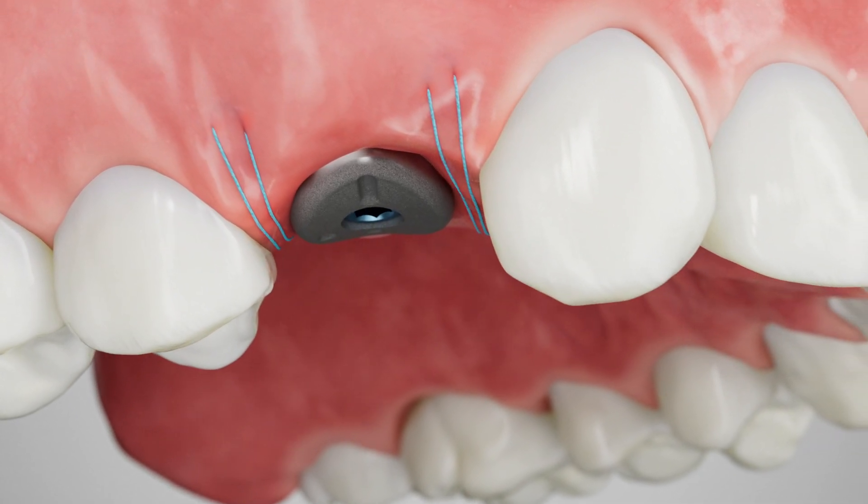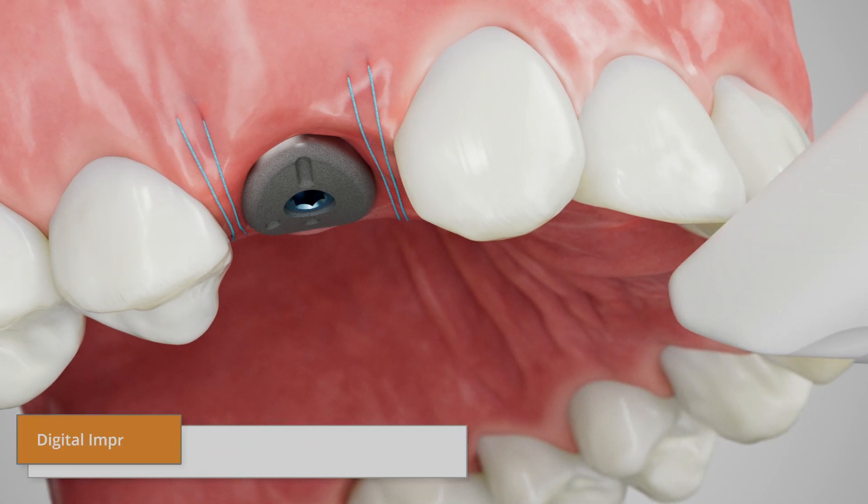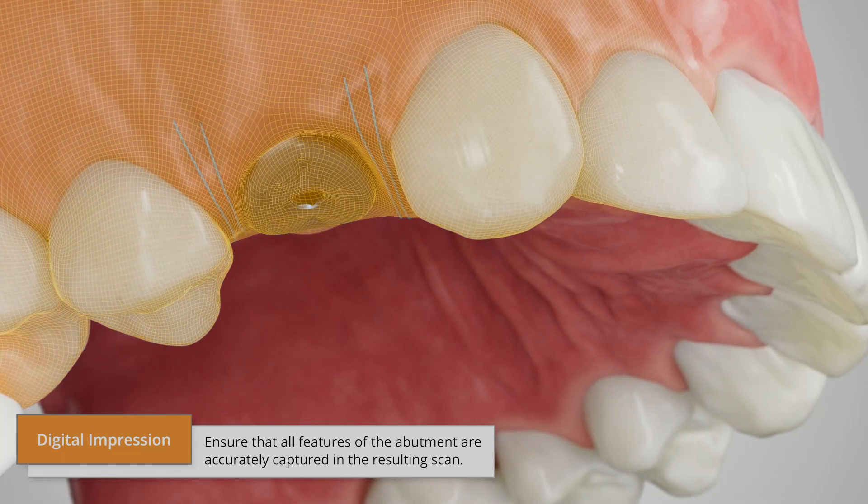The SmartShape workflow supports both digital and traditional impression taking methods. For a digital impression, scan the occlusal profile of the SmartShape healer and the surrounding dentition.